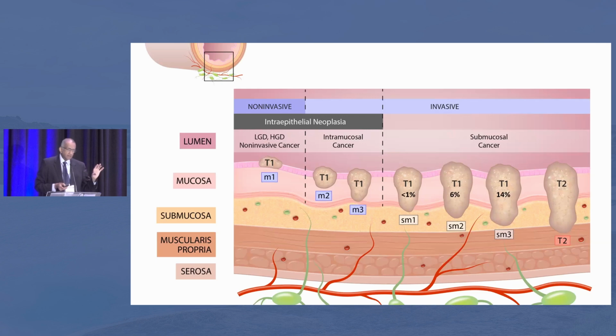I want to use the term compartment because as long as the pathology is limited to the mucosal compartment and you remove it, whether you remove it en bloc, piecemeal, as long as you remove it completely, you can achieve eradication and you can avoid recurrence. So that's something to keep in mind.